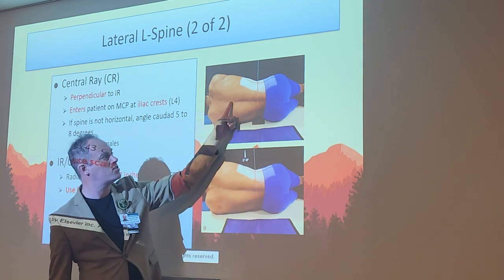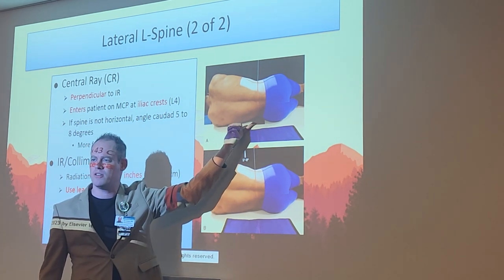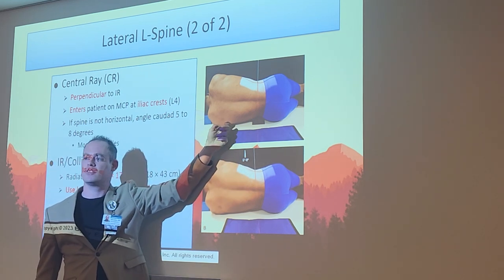You'll be able to get that nice straight line like we see right here. But if you can't do that, like you don't have a sponge available to do so, you can add this slight angle, 5 to 8 degrees caudad, and it will basically do the same thing as this.